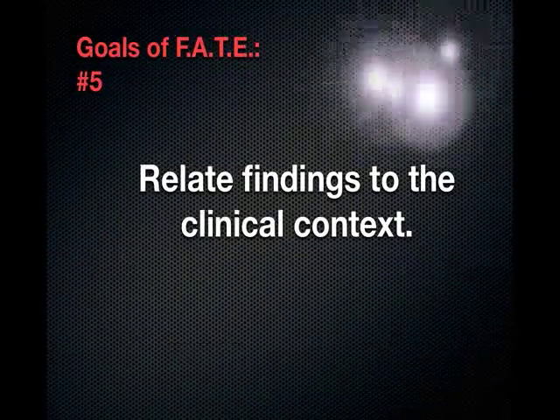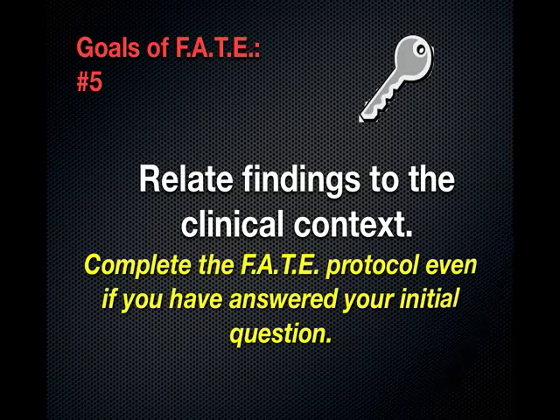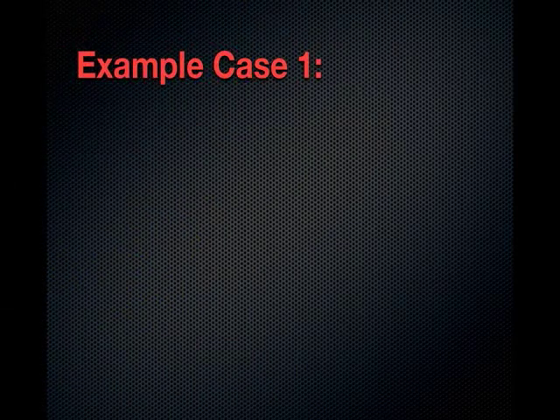And the fifth goal is to relate the findings to the clinical context. So if you have a particular question in mind and you start your exam and you think you've answered your question, I encourage you to do all three views of the heart and the views of the pleura, because you may actually come up with some other information that guides you or reinforces your beliefs. There are a few cases.